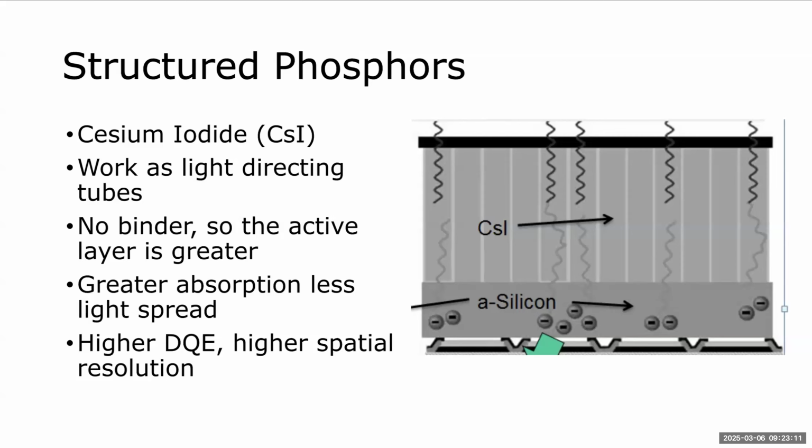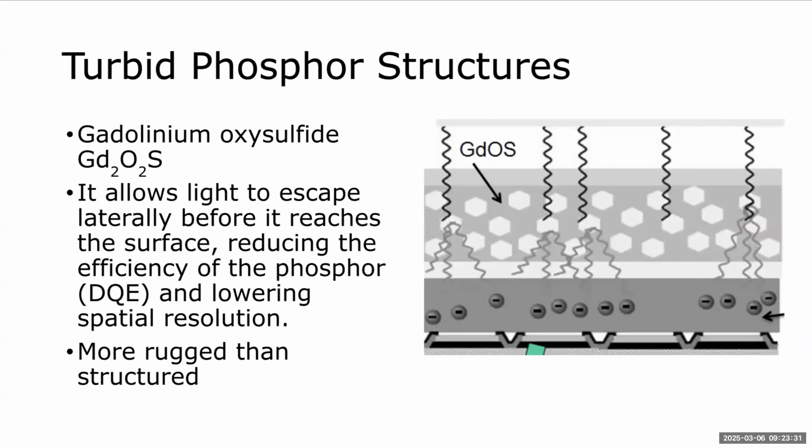Generally the detectors that I have used, and like that we have in the lab now and had in our old lab, were cesium iodide type detectors, which would be considered indirect conversion because there's a light step.